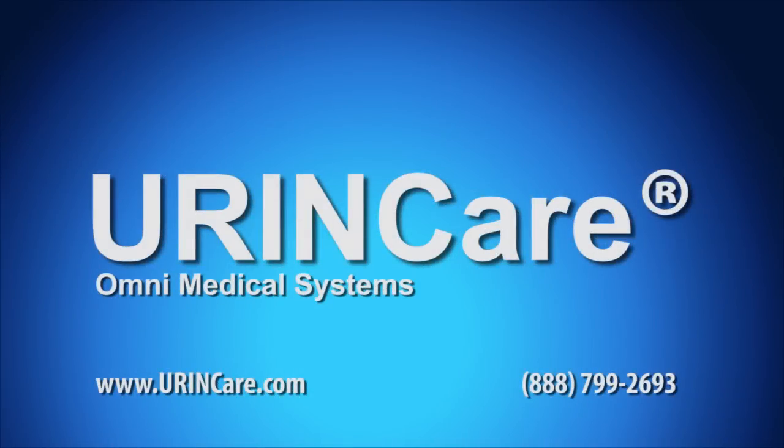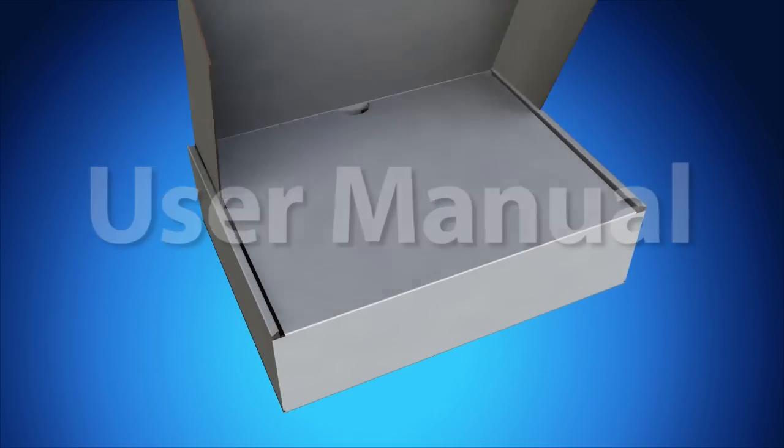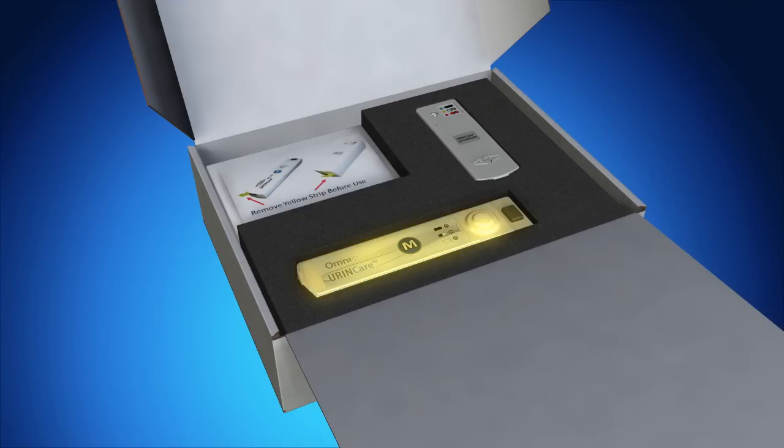UrineCare Incontinence Management System — The User Manual. The control device kit contains the user manual, the control device, two battery packs, a charger, and a wall adapter power supply.